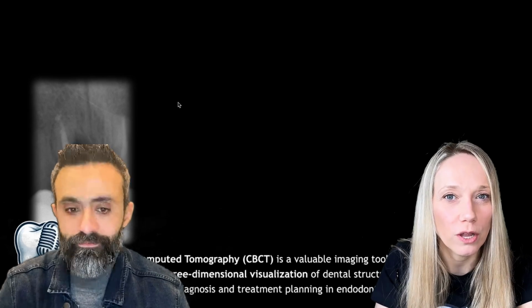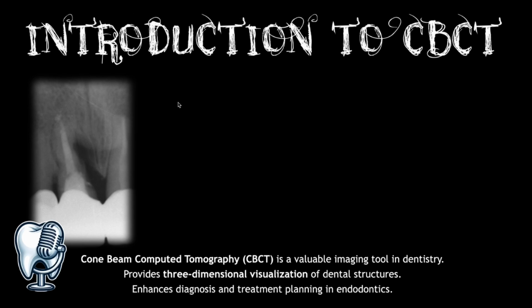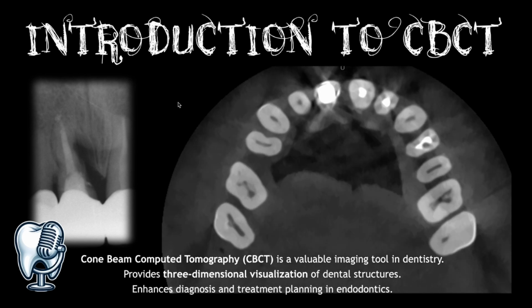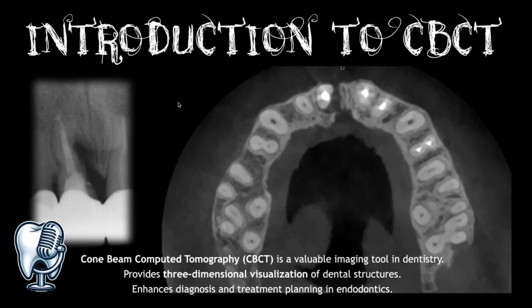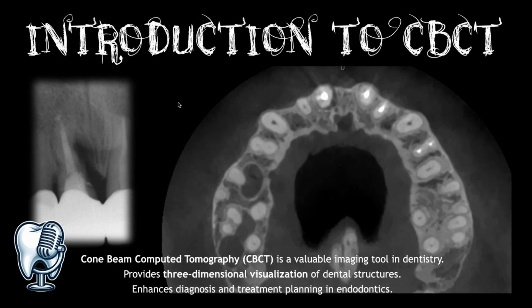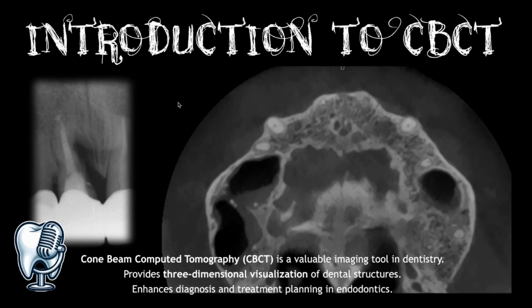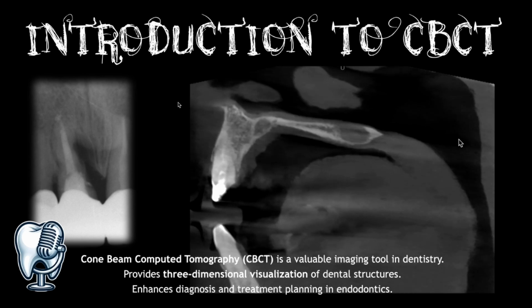with our patient's tooth. Look at this central incisor. I take a bidimensional x-ray and I imagine that there are a few resorptions on this tooth, but when I take the actual 3D image with a CBCT, I have a more comprehensive view of what is happening with that tooth. And so I know more about what I can do for the patient because she cannot get an implant with that kind of bone, for example. And so I have all of my list of options for the treatment planning.